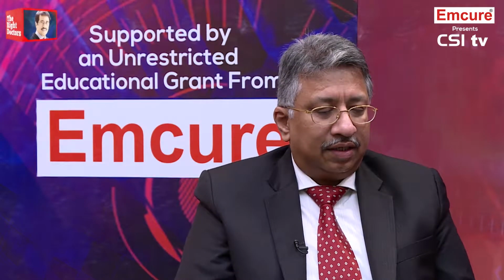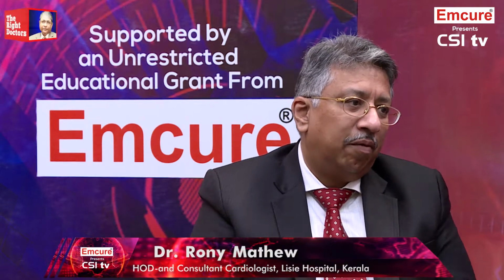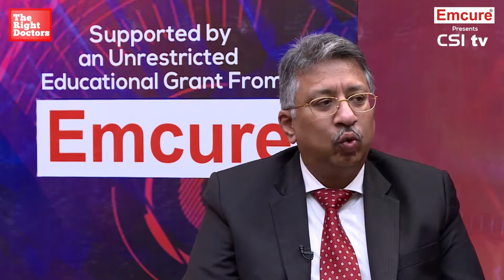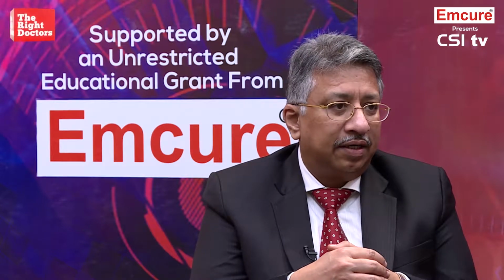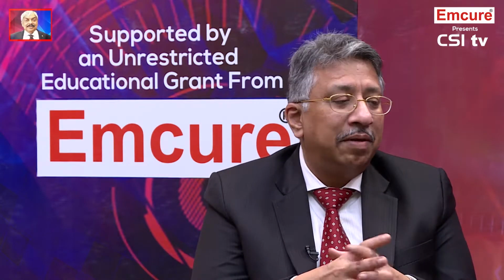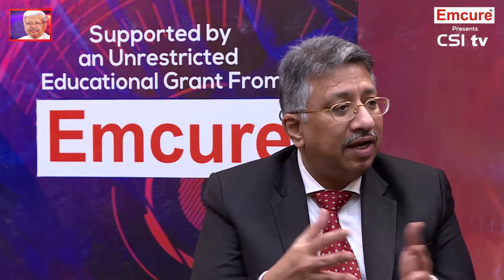See, at the outset, we must understand that angiogram in its present form has its own limitations, because an angiogram is basically a 2D image and it's basically a luminogram. So, to define if a lesion is significant or not, we use an arbitrary figure. The left main, we say it is around 50%. But this 50% is not a holy grail, in the sense there may be lesions that are 45% that are significant. There may be lesions that are 55 or 60% that are insignificant.